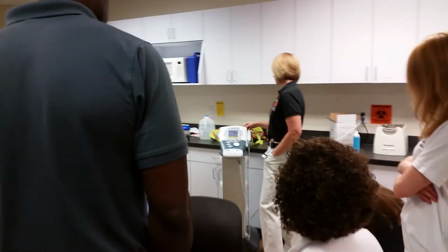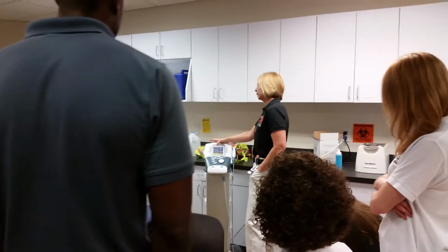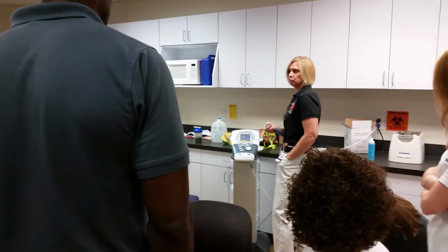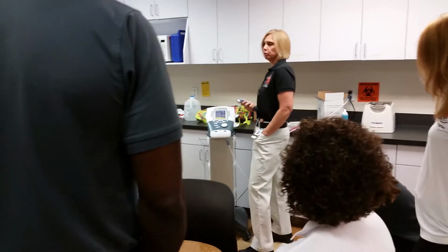So you go to edit. So you can edit. And now you can adjust the parameters. Now, there's a head warmer on this. Please make sure the head warmer is turned off because that can be very confusing as far as making sure you're getting to the therapeutic level and practical purposes.